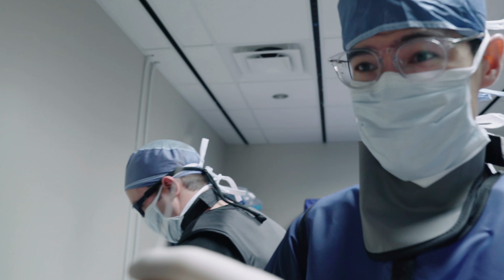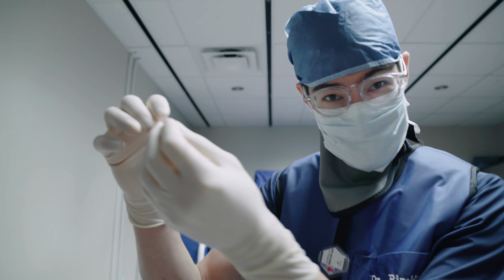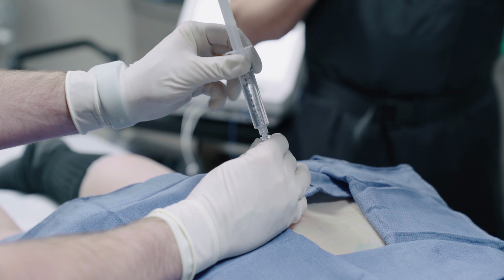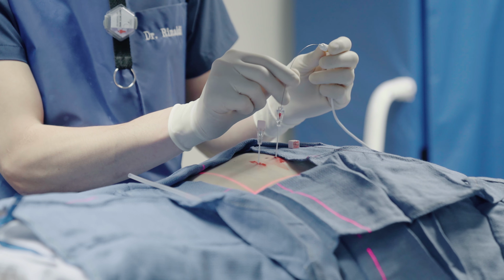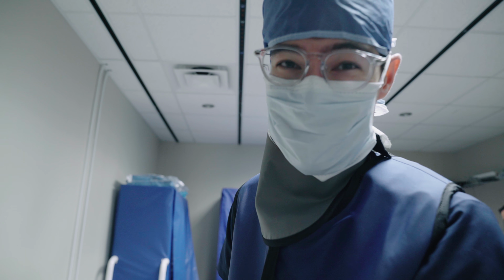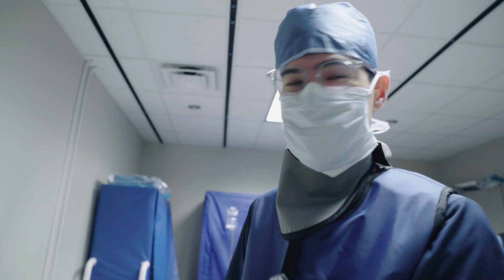So here are the needles that we use. They have a little curved tip on them so we can steer them a little bit easier. We'll place the needle first, take the center stylet out, then give some local anesthetic, and then we put our probe down through. The probe will actually heat up the tip of the needle, and that's essentially how the ablation works. It uses radiofrequency energy, essentially vibrating back and forth, and that's how it creates the heat.